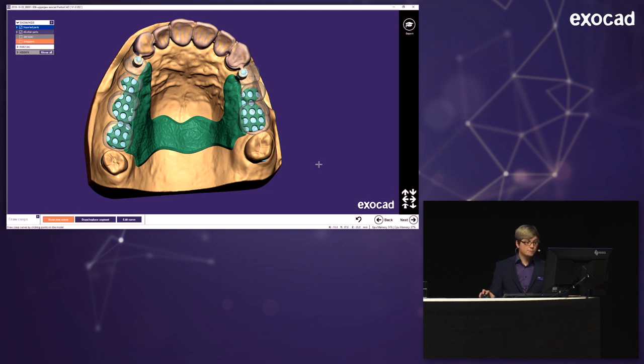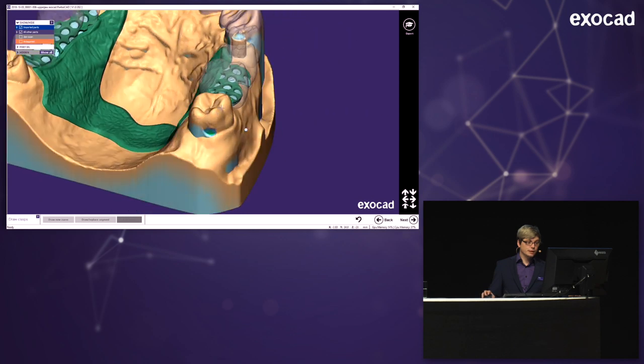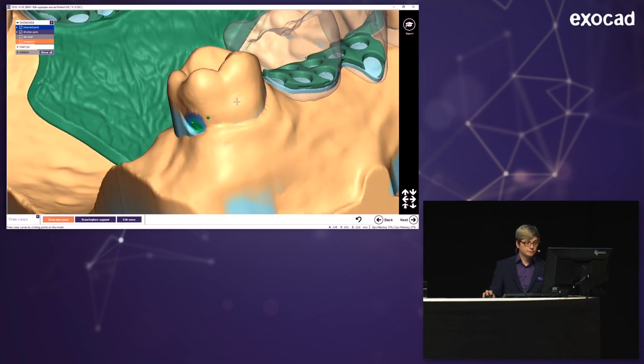So on to the next step, where I draw my clasps. And this is pretty easy. I just choose the first tooth and start clicking away. And just draw my clasp point by point.